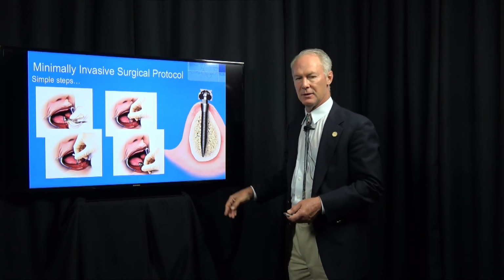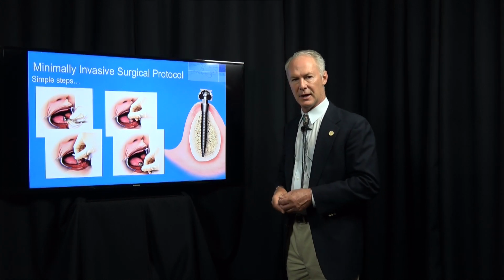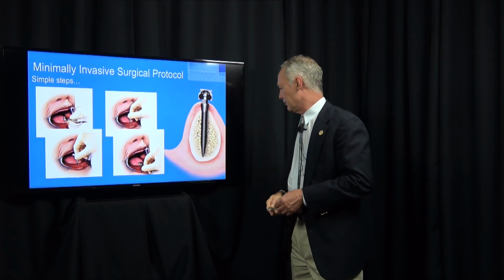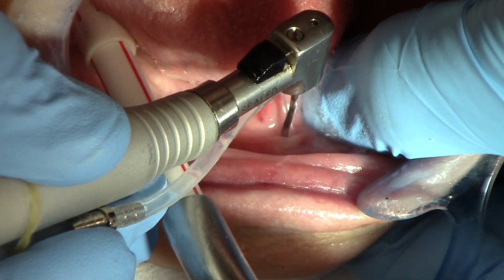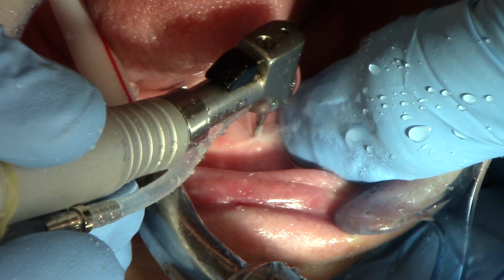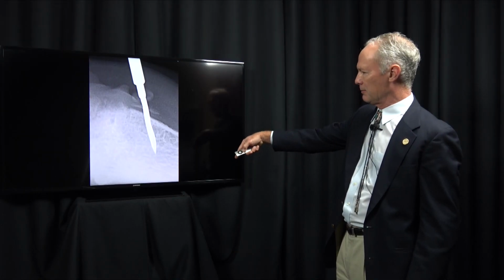This doesn't happen all that often, and they're very stable as long as you've got at least 10 millimeters in this cortical bone in the coronal part and the medullary bone in the body part, and you have multiple implants. This is high water, up and down movement, and since I'm trying to engage the cortical plate apically, I'm going a little bit deeper. This just is a radiograph to tell me where I am.